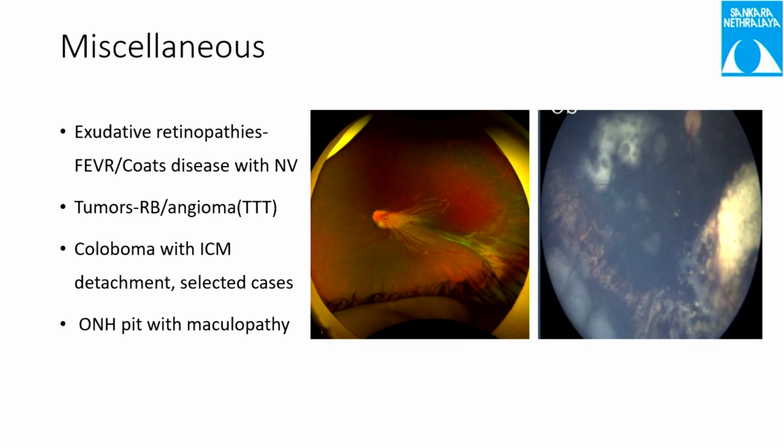And we prefer to do transpupillary thermotherapy, which is also a kind of photocoagulation mechanism, but we make use of the thermal burns. We increase the temperature, basically. It works on the principle of damaging, you create a coagulation based on thermal energy.